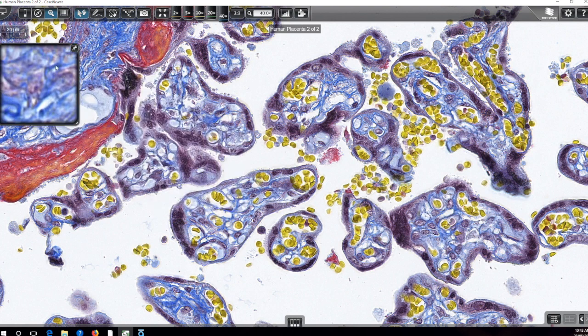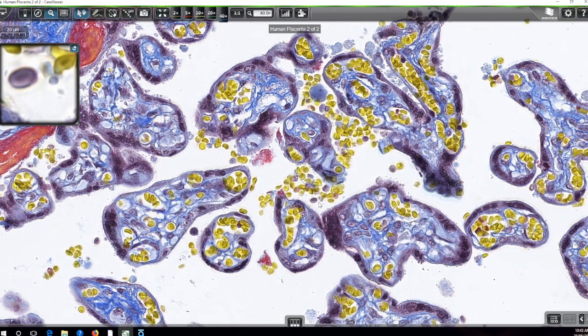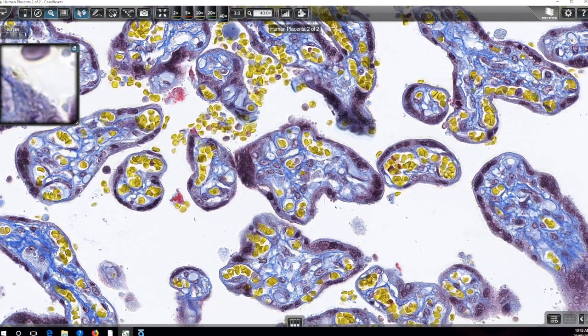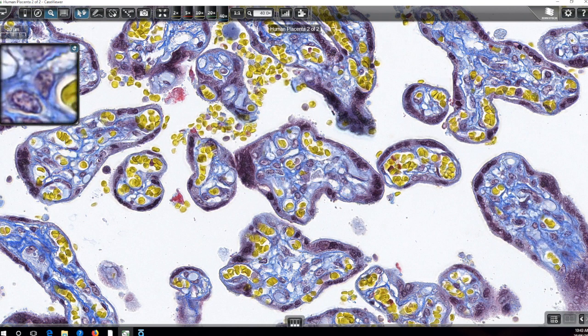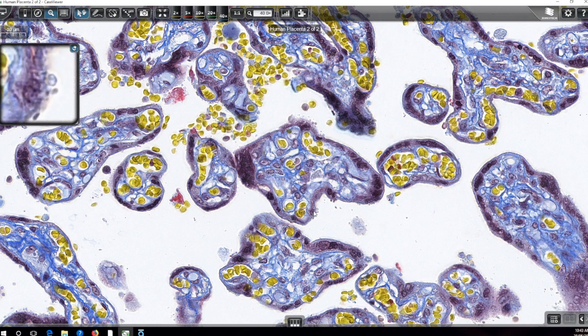The other way to use this is to pin it using that little tool in the right hand corner and then locating an area of interest. Now you can use your cursor and as you move around on the full size image, you get the magnified view in the magnified window box.